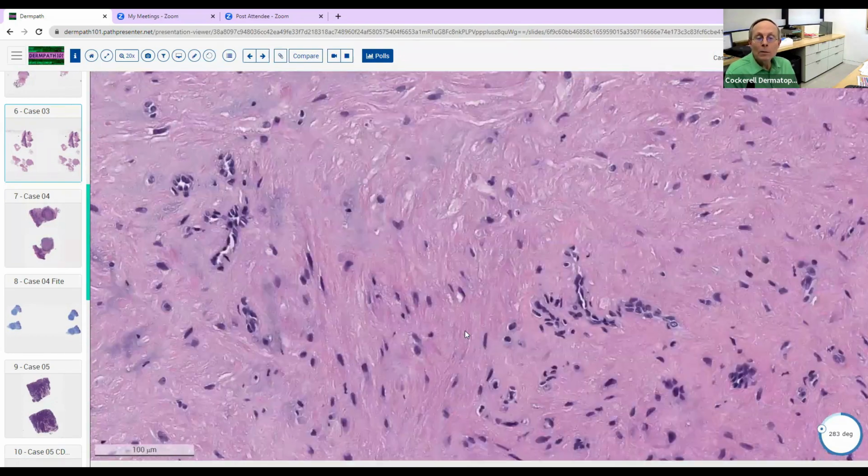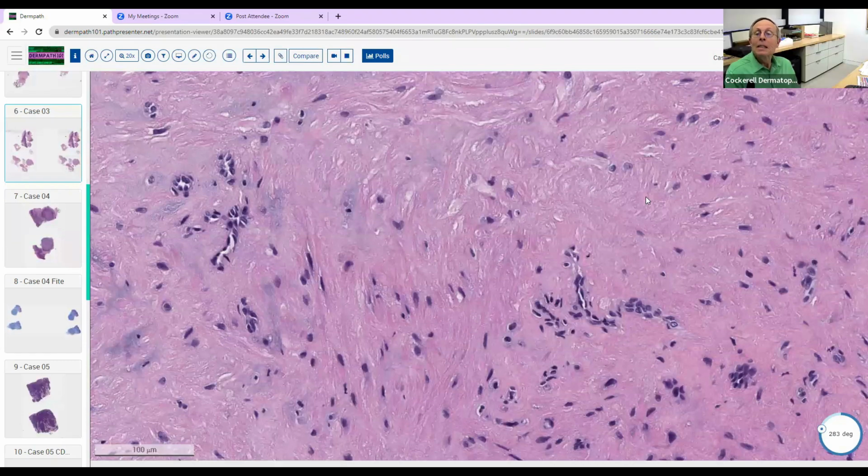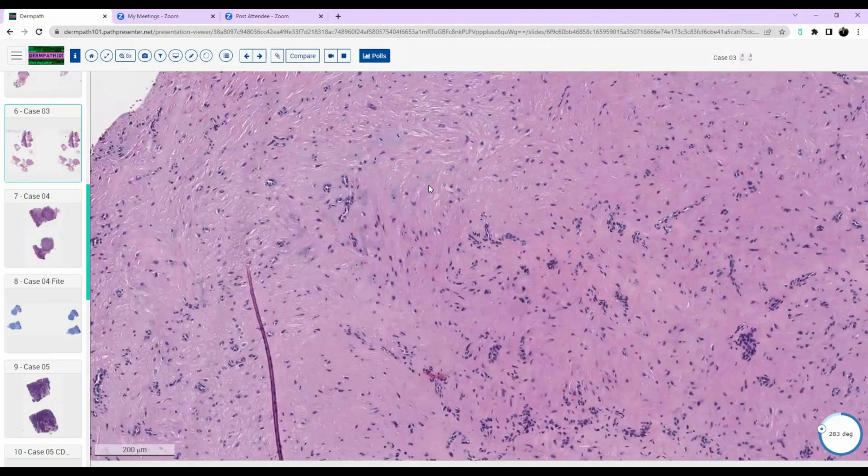And then what about this material in this area? It's just kind of wispier. Yeah, those are collagen bundles. They're really closely, densely packed together, and they're almost becoming homogenized in a way. So you can imagine this thing is beginning to form a nodule. It's losing its cellularity.